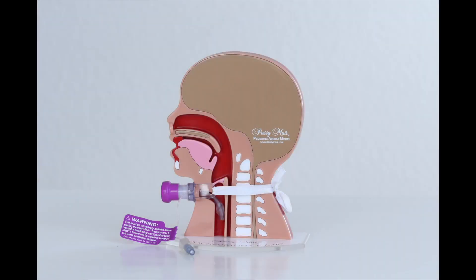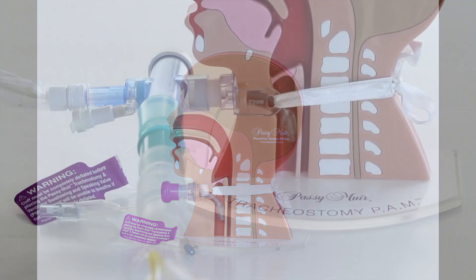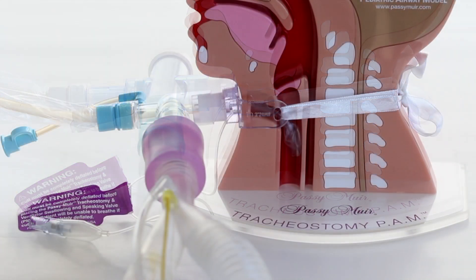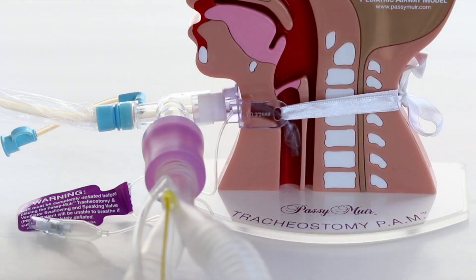Ventilator connections. The Passy Muir valve was invented by a patient for patients who require mechanical ventilation. The Passy Muir valve and adapters were designed to easily be attached in line to ventilator tubing and other adapters, including in-line suction catheters. The valve can also be placed in line and attached directly to the 15 millimeter hub of the tracheostomy tube.